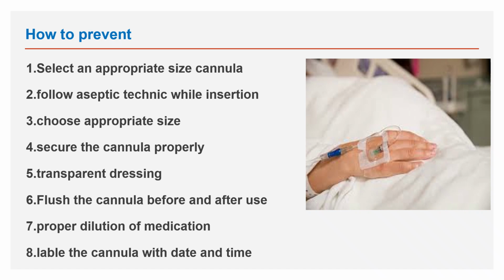Transparent dressing has to be kept. Why are we keeping transparent dressing? Because the pricking site should be visible, so that we can understand whether redness, swelling, anything is starting from the initial stage itself.